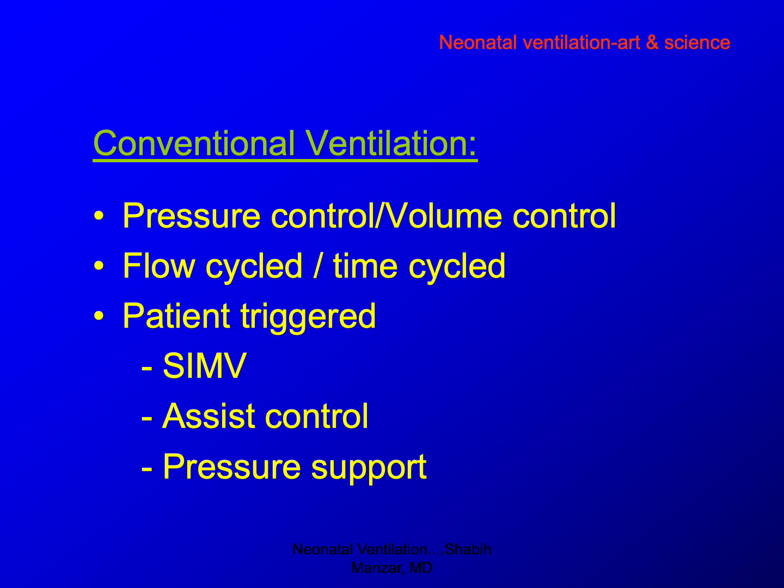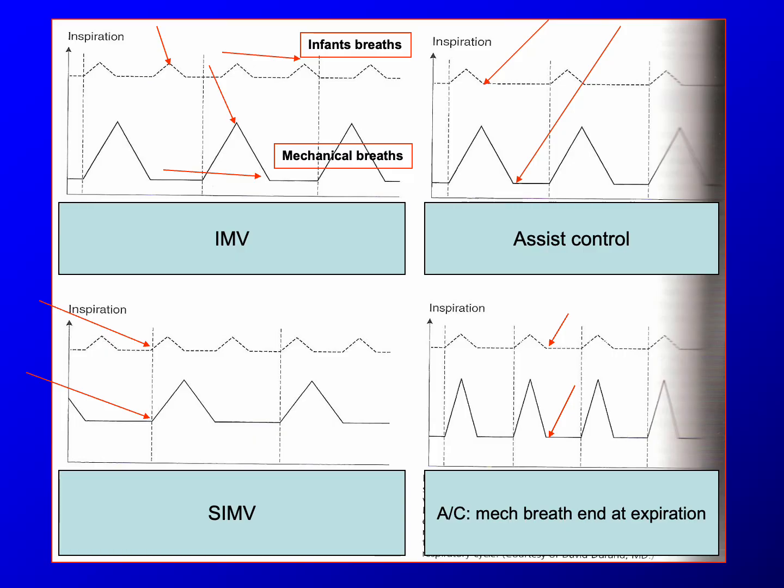So synchronized intermittent ventilation is one, assist control and pressure support. The concept is the same. Just remember the analogy of side wheels on the bike: you are just supporting, and when the time comes that the patient is doing everything well, you take out that support and let the patient extubate. Again, these are some graphics. Like I said, these are old graphics. There are nice presentations of these graphics these days, but the whole idea is, I'm just doing a voiceover on this old presentation as some of you requested.